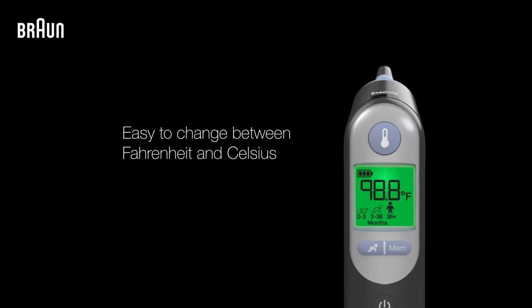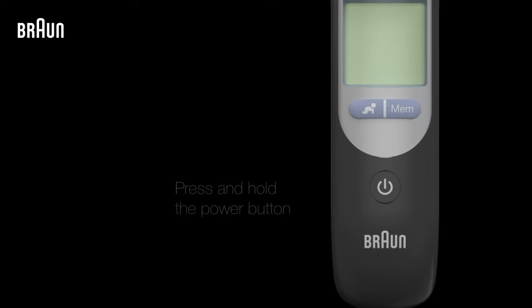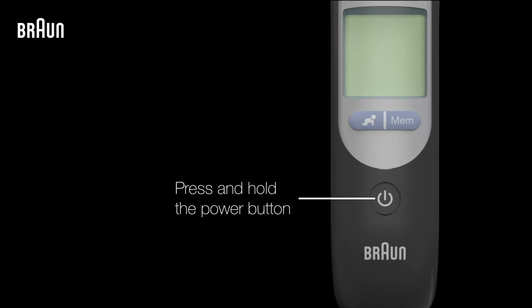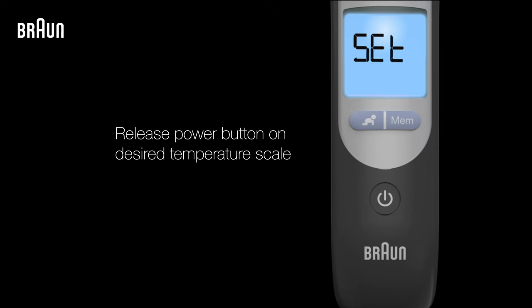To change the temperature scale of your thermometer between Fahrenheit and Celsius, the thermometer must be turned off. Once it's off, press and hold down the Power button. The display will then show the different temperature scale options. Release the Power button when the temperature scale you'd like to use is shown.